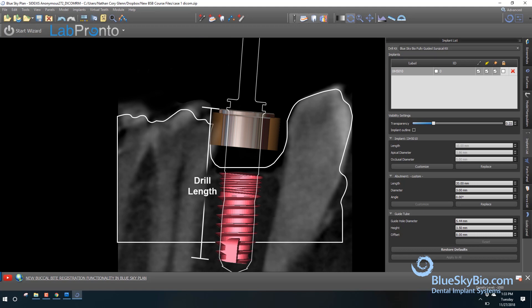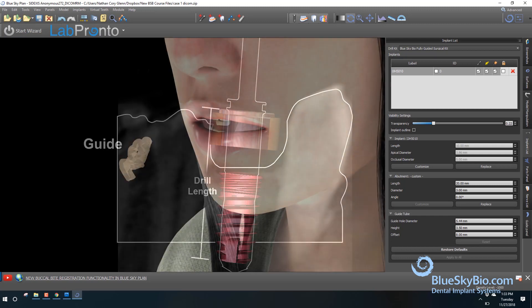The drill length creates the osteotomy at the perfect depth for the relevant implant. Print the surgical guide and insert the metal cylinder.